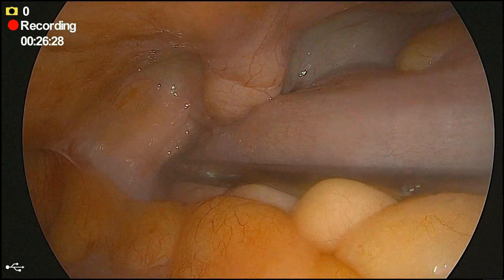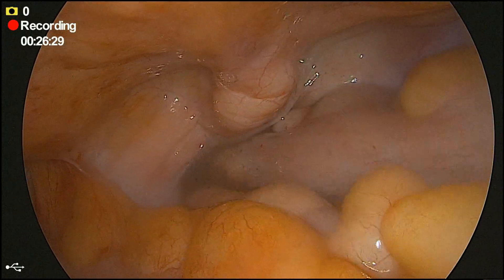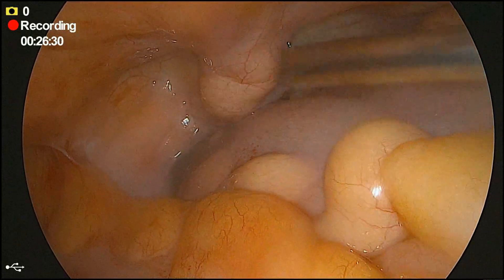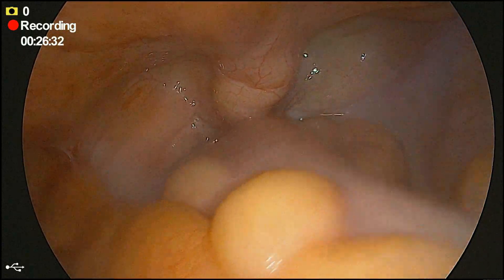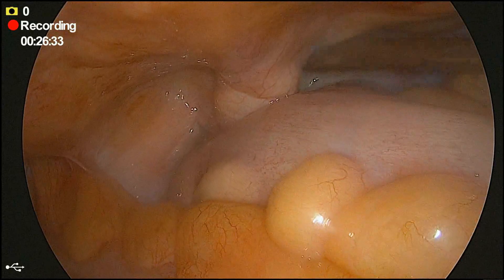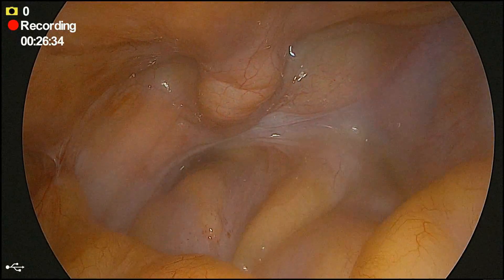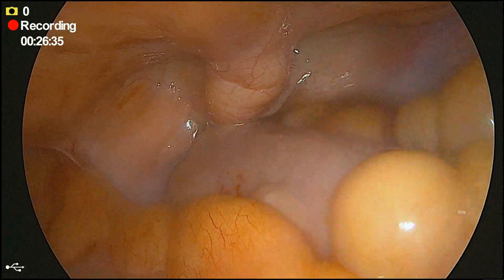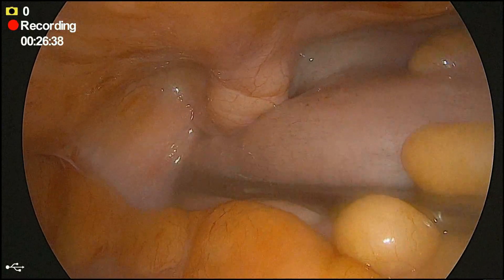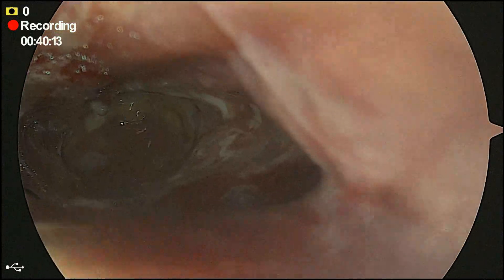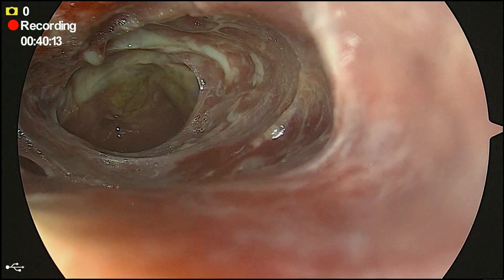Here we have given a wash. We have done a thorough irrigation and lavage and we have placed a drain in the pelvis, which is the intraperitoneal area.